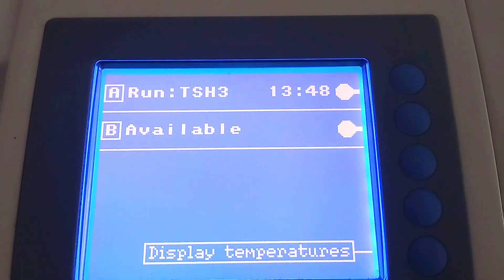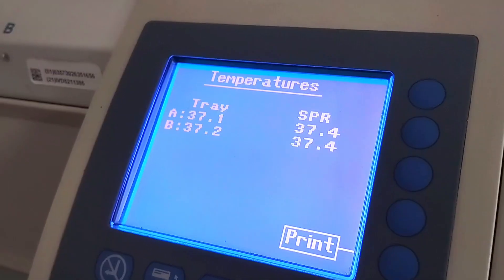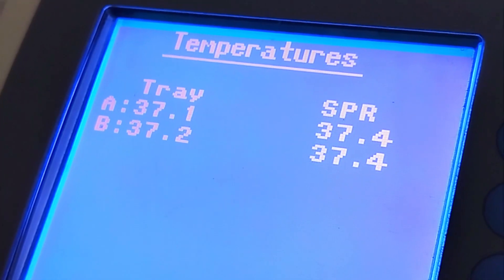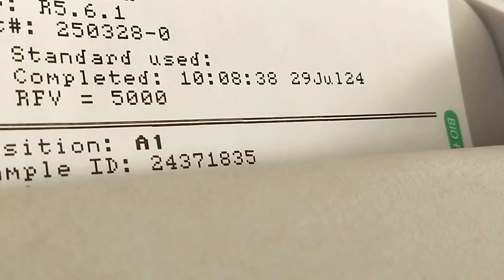Select the start option, then enter the user ID. The completion time displays once the run has successfully started. By selecting 'display temperature,' you can see the current temperature. It is very important to keep it around 37 degrees Celsius.